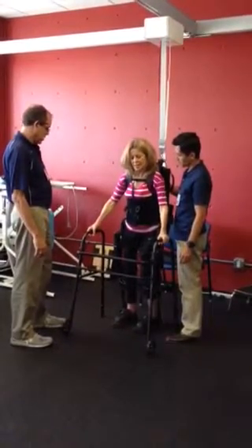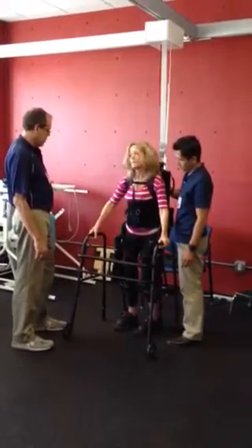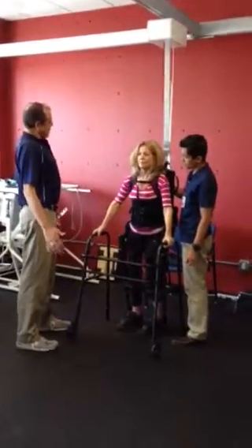I just got too much. One. One or two. Come on, you can do it.